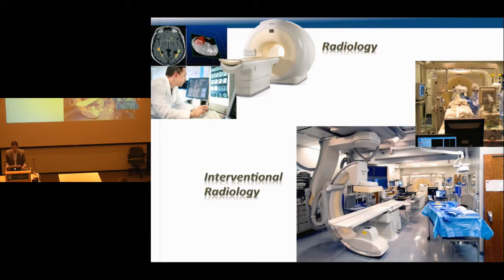So that looks at the different technologies we're developing for diagnostic imaging. If you look at my first chart, there were three different phases. The second phase is the reaching part, which I'm sure a lot of you are already familiar with, where we're trying to fuse information identified by the radiologist, such as tumor segmentations, structure lesions we're trying to biopsy, or critical structures we're trying to avoid, and bring all that information into interventional radiology. So it's about fusing preoperative imaging with intraoperative modalities.